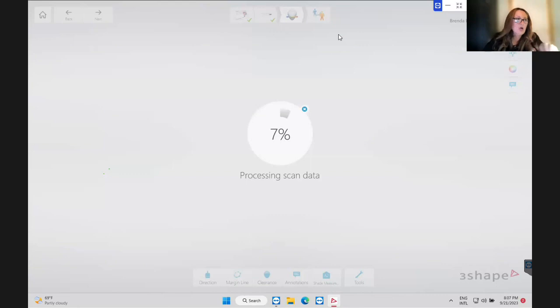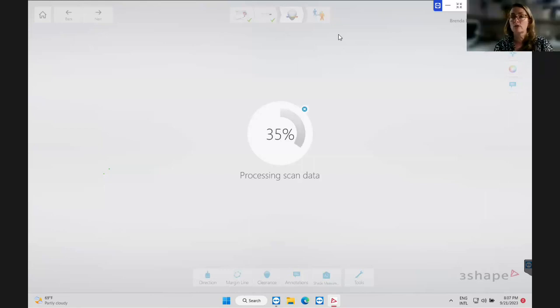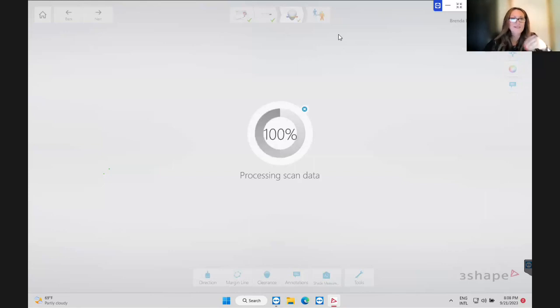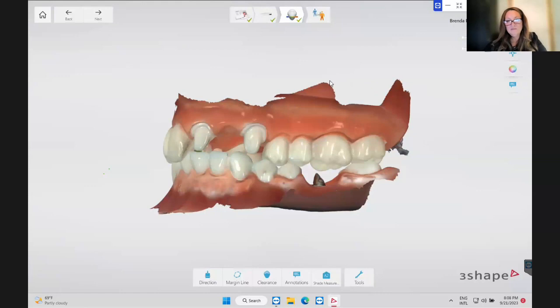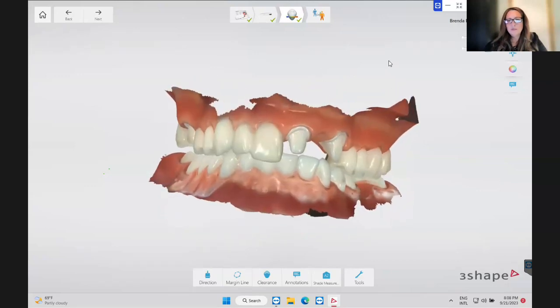Post processing can take a while if you took a long time scanning. Full arch scans always take longer to process. Regarding scan scope for single crowns - do whatever your doctor normally does; quadrants are fine for single crowns but for implants or large bridges you want a full arch scan for a stable, accurate bite registration.